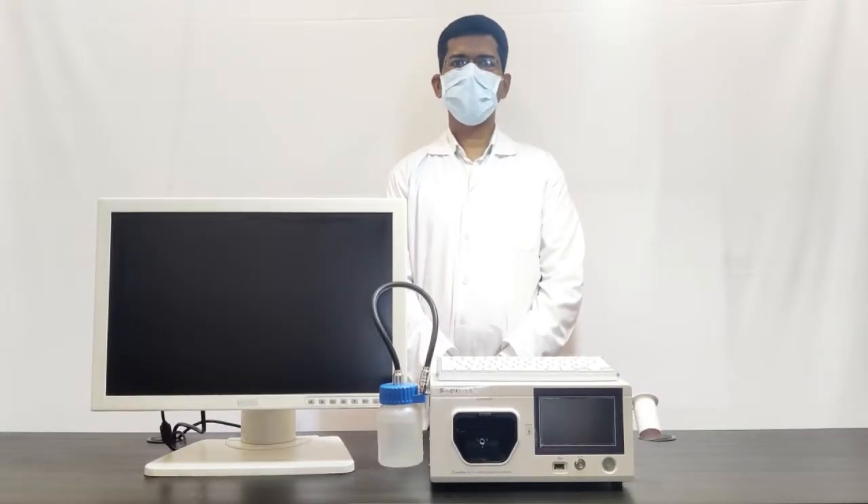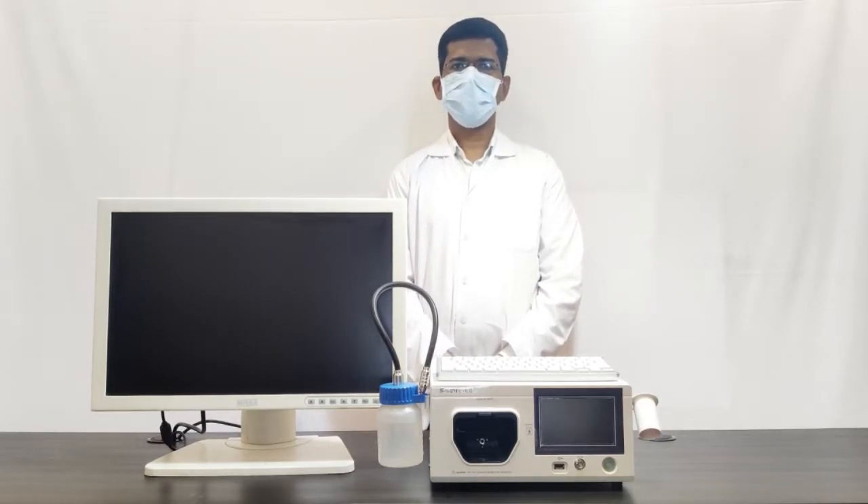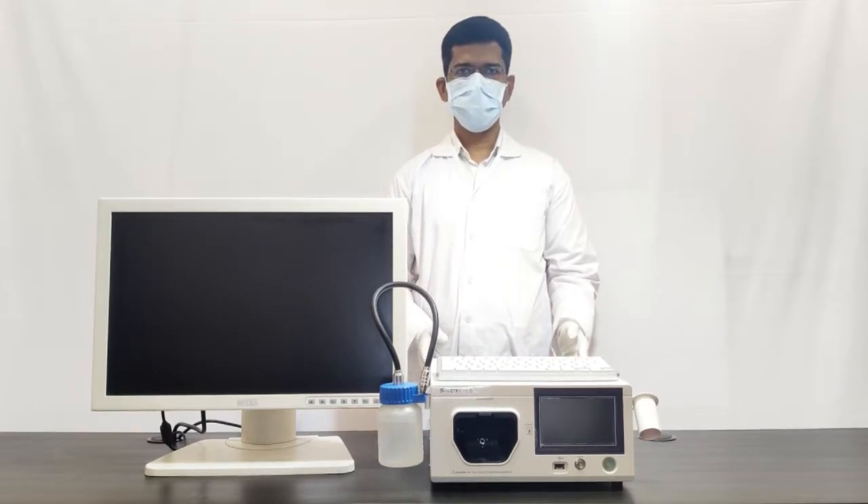Hello everyone, welcome to Automate Endoscopy. I am introducing the Smartide 2 Plus system. This is a next generation digital HD video endoscopy system.